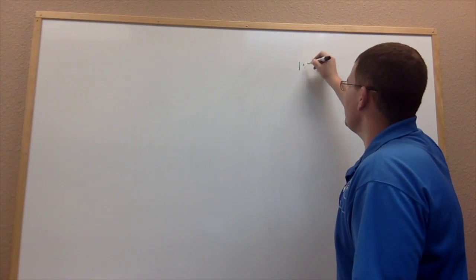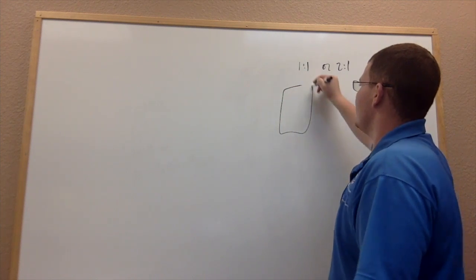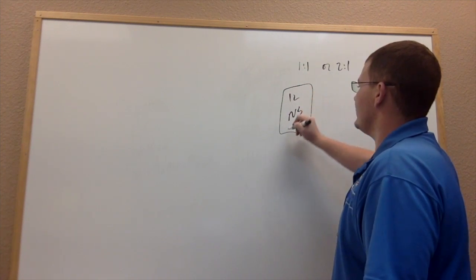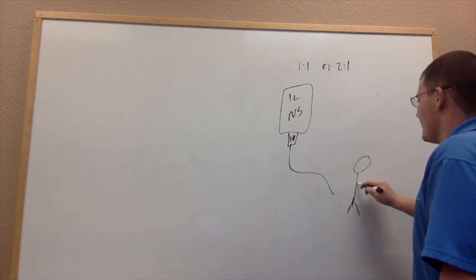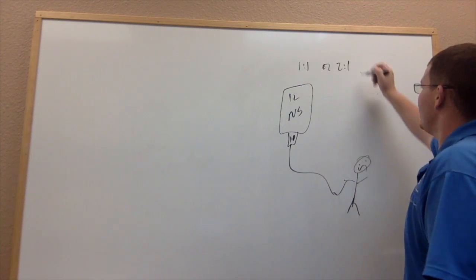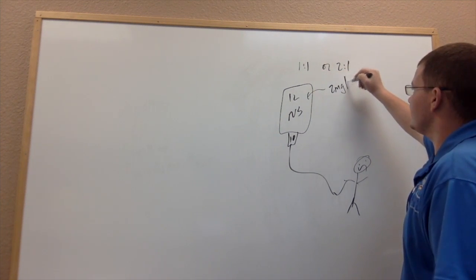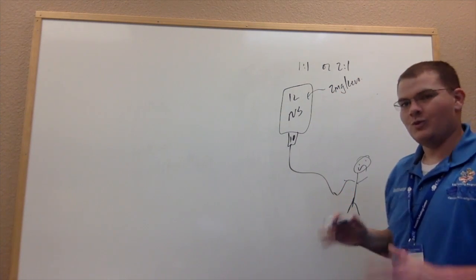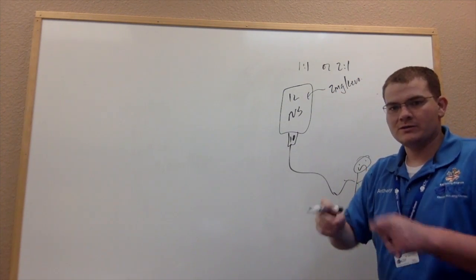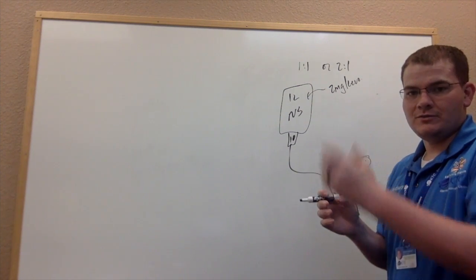So if I can always get you back to a 1 to 1 or a 2 to 1, you're going to be fine. So with Levophed, my deal is 1 liter normal saline, 10 drop set, sick patient, hook them up. I'm going to add in here 2 milligrams of Levo. And you can add in 1 milligram. It's just going to water it down a little more. It's no big deal. You're just going to get more fluid to your patient. You have to count more drops as you get to higher dosing.